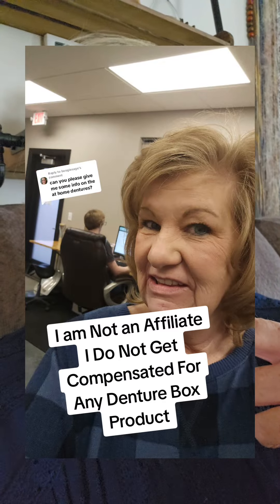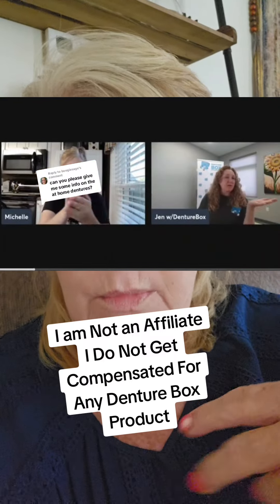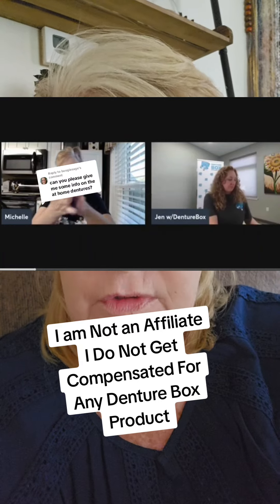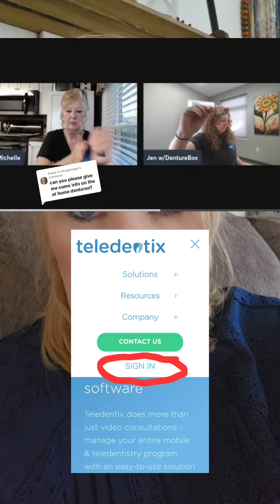These are my DentureBox dentures. This is an at-home company — they send you an impression kit and you do the impressions at home. They have the Teledentix program where you meet with them via video chat and they walk you through the impressions. They make it very easy.